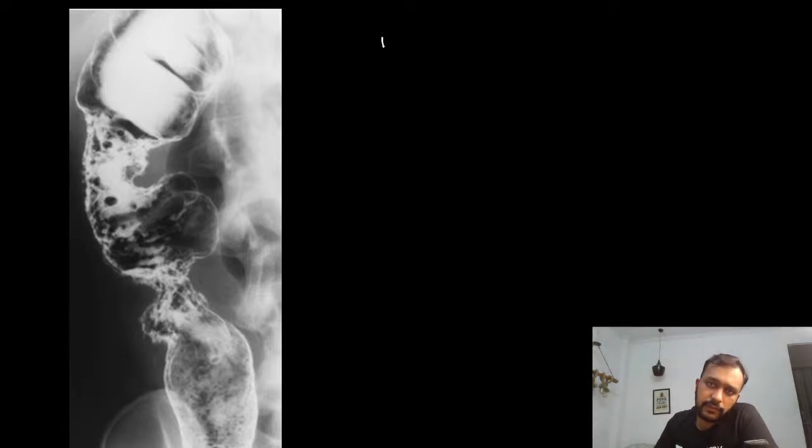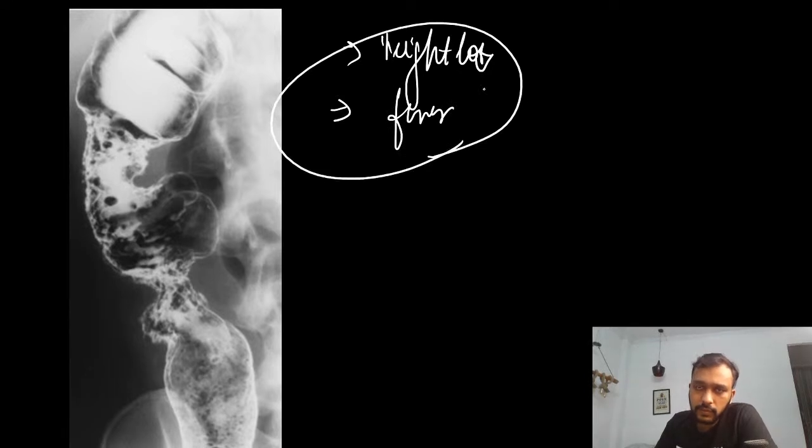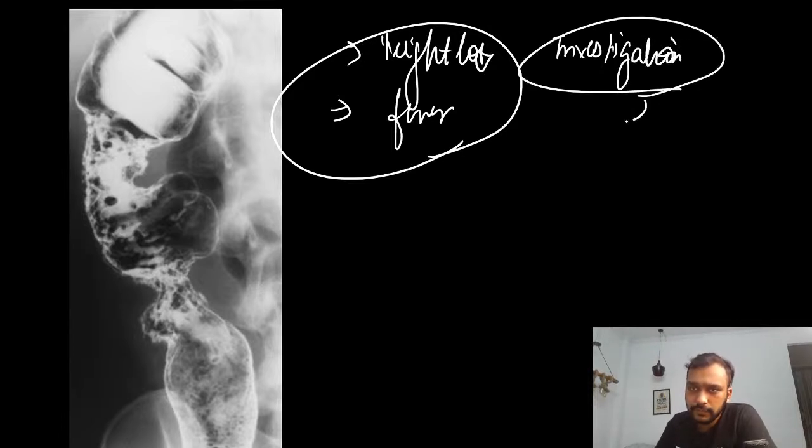So the patient had a history of weight loss, and there was a history of fever also in this patient. Okay, so first of all, tell me what is the investigation that is being shown here. Come on guys, what is the investigation being shown here? Barium enema, anyone else?